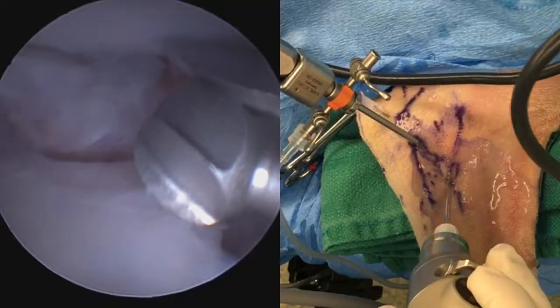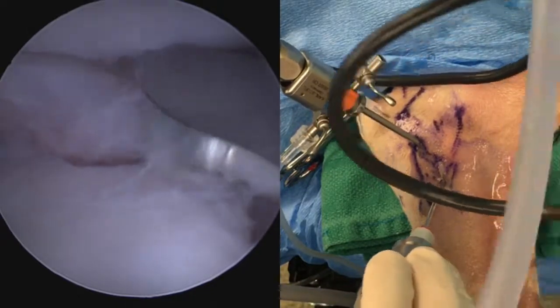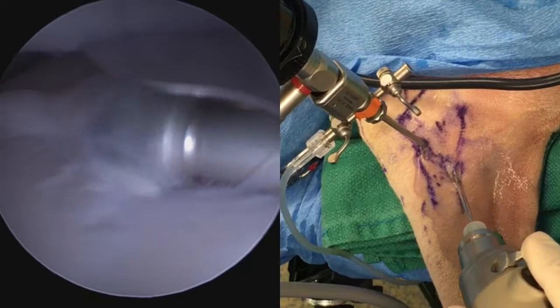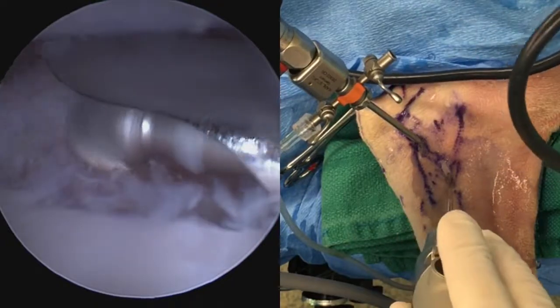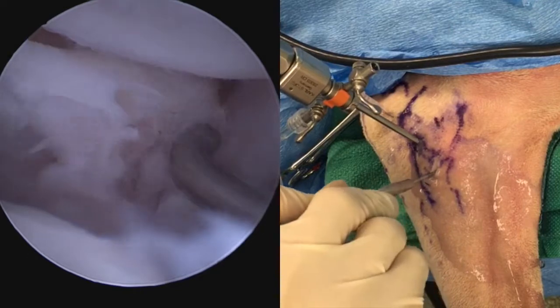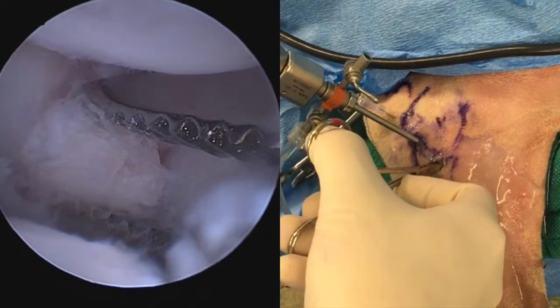My preferred method for coronoid fragment removal is to create a little more room for grasping forceps by burring away some of the caudal margin of the fissured region. Here we can see that debridement happening with our burr, and now that fragment is a lot more isolated and ready to remove.